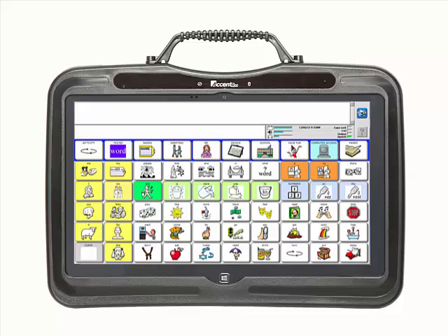In this video, you will learn how to enter and exit the toolbox on your Accent. It is important to know how to enter and exit the toolbox because this is where you go to make adjustments to the communication device.